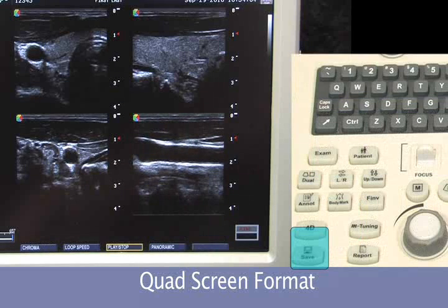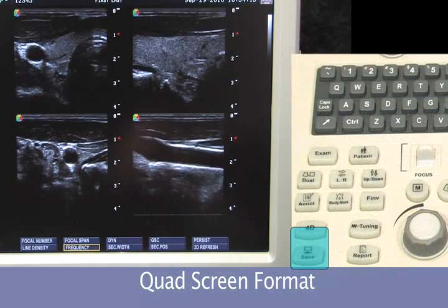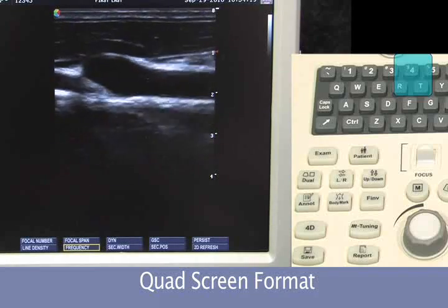Freeze. Save. To get back out of this to regular imaging, we're going to simply press the four key again, taking us back to a single B-mode image.